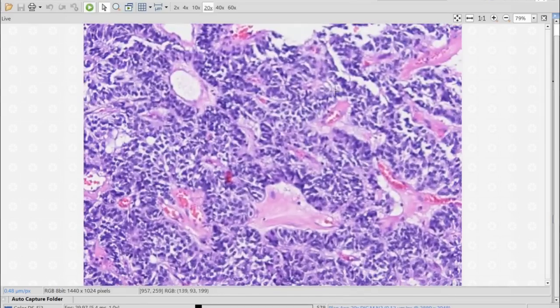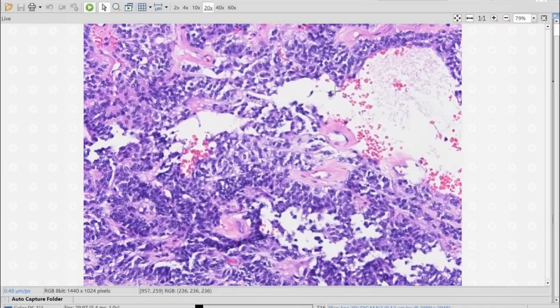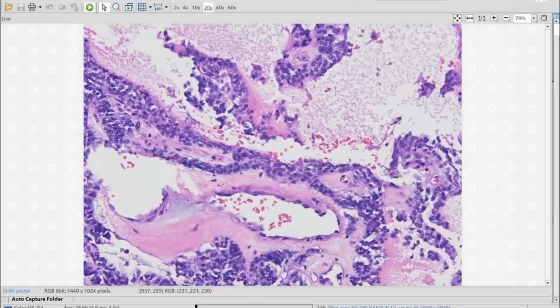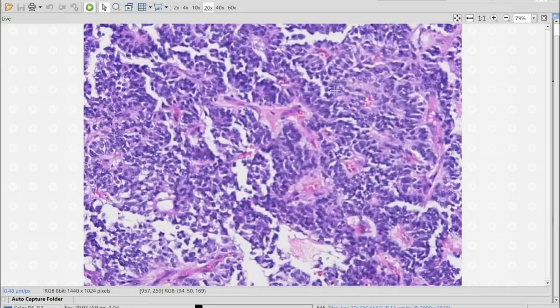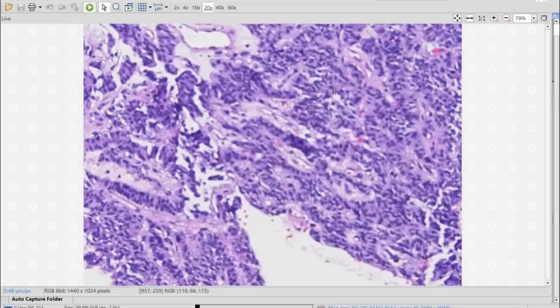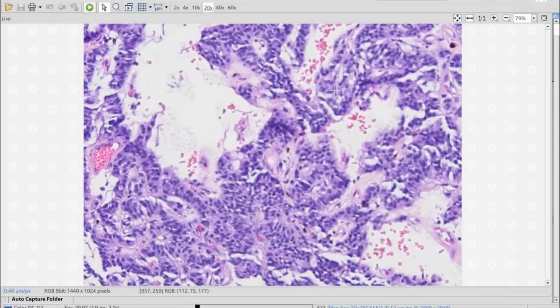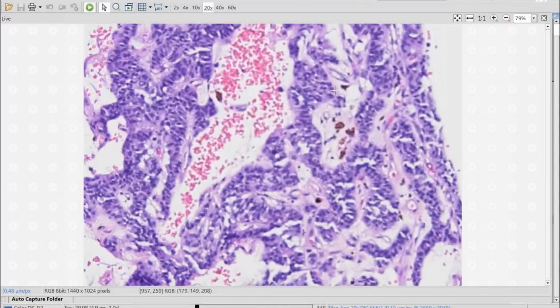Some of these can have ganglion cell differentiation, which can lead to more diagnostic issues. And they frequently express keratins. That's something else to have in mind. You don't have to call these neuroendocrine carcinomas. In the filum, paragangliomas frequently express keratins and can be very strong sometimes. So this is another diagnosis to have in mind when you're in the filum. Not very common, but definitely a tumor that also occurs at this location and can be mistaken for myxopapillary ependymoma.